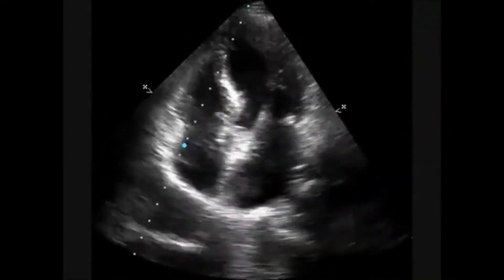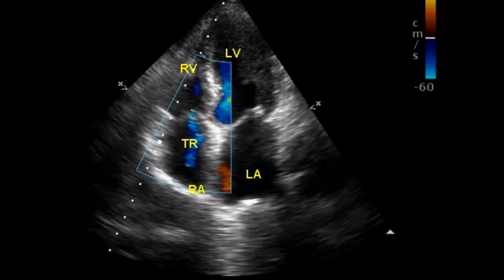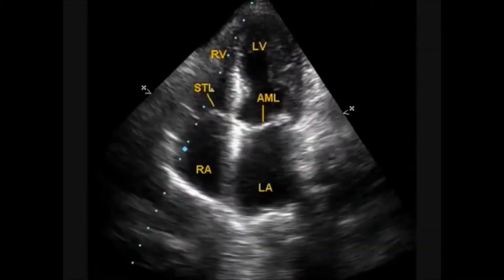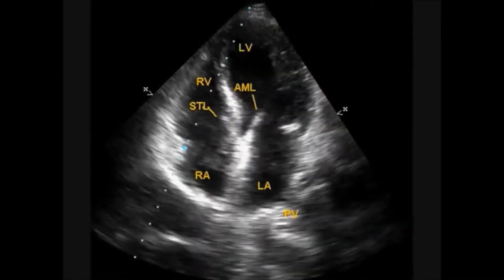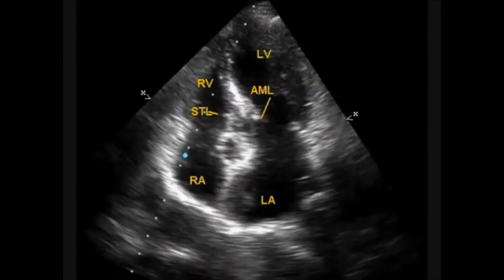In addition, all four chambers are marked here. In the still frame, the closed position of the septal tricuspid leaflet and anterior mitral leaflet are seen. This is the open position of the septal tricuspid leaflet and anterior mitral leaflet.